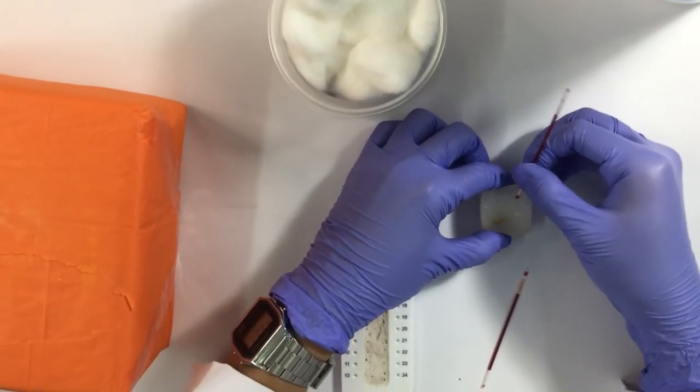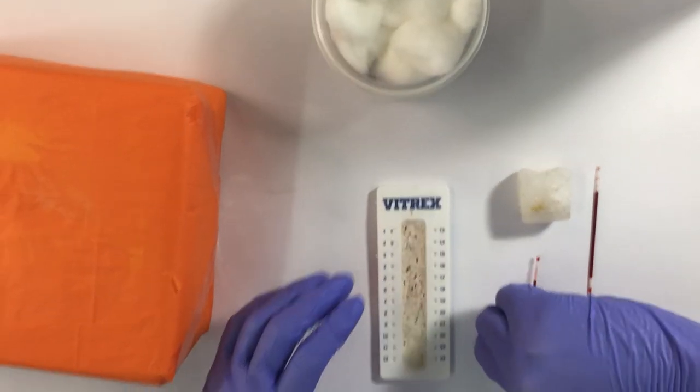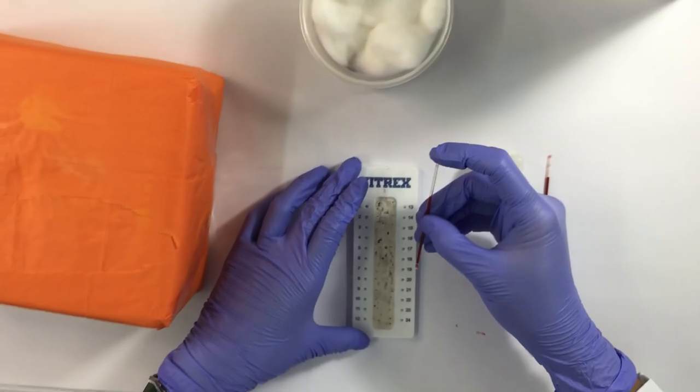Care must be exercised when sealing the tubes, because when too much pressure is applied, the tubes might break.